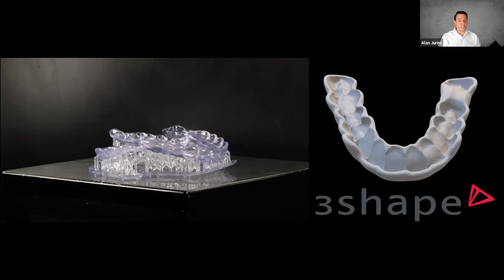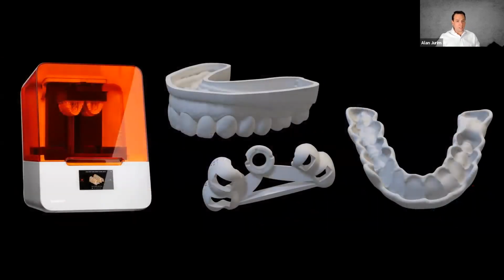For us, it's as simple as hitting Control C and Control V and being able to print a duplicate very, very effectively and easily. So splints are a tremendous benefit, and really a great way to increase production in the office and to pay for a lot of these systems because we do so many of them.